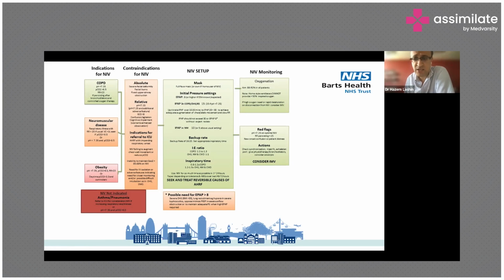Morbidly obese pneumonia patient, would you use NIV during weaning off the ventilator? Yes, I would use NIV. So if the patient is extubated, I would extubate him straight into NIV to try and maintain their ventilation and their gas exchange. Thank you for the question.